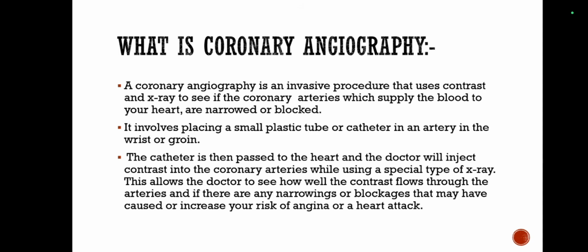So first of all, what is coronary angiography? A coronary angiography is an invasive procedure that uses contrast and X-ray to see if the coronary arteries, which supply blood to your heart, are narrowed or blocked. So angiography is a procedure.